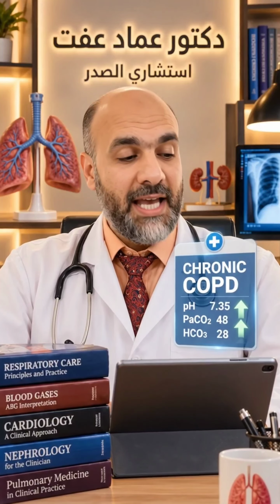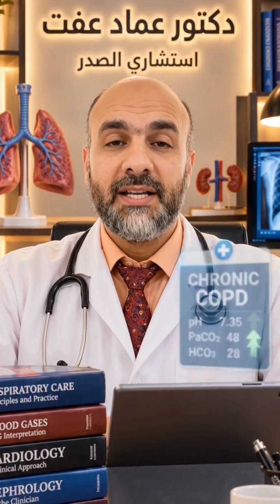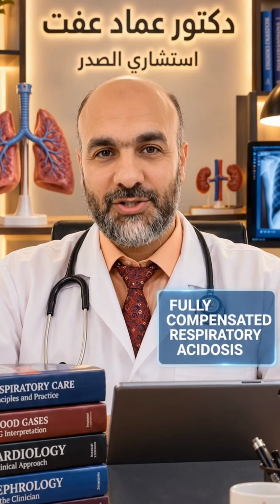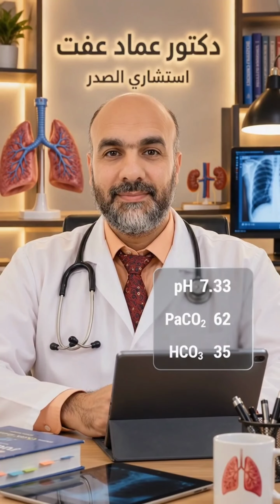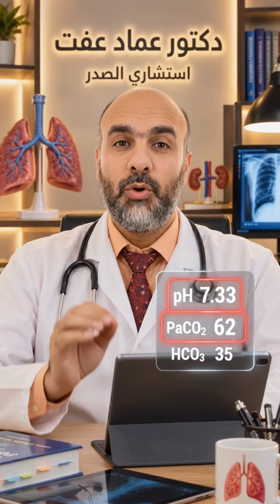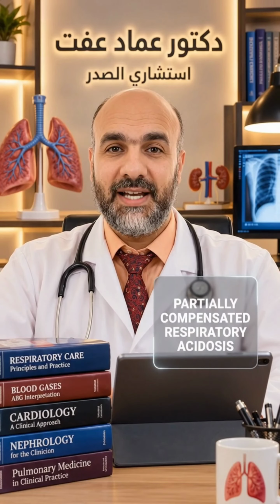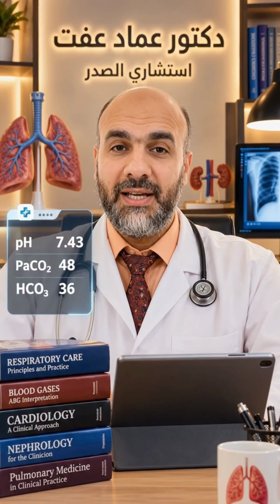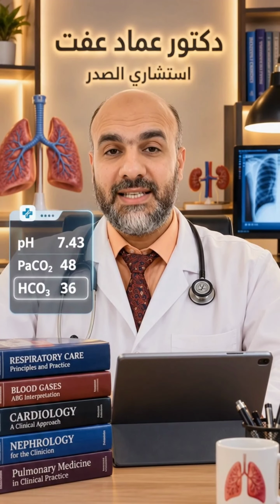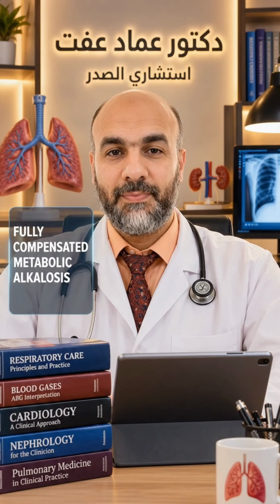Low normal range pH, high PaCO2, and high HCO3 suggest compensated respiratory acidosis. Low pH, high PaCO2 with elevated HCO3, the kidneys are compensating. High normal pH, high HCO3, and elevated PaCO2. This is compensated metabolic alkalosis.